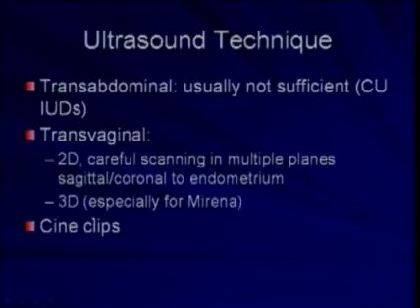3D ultrasound can be especially helpful for women with the difficult to visualize Mirena. Finally, recording a cine clip can be helpful for study after the examination to assess the position of the IUD.